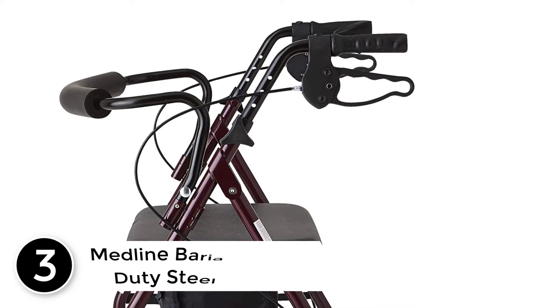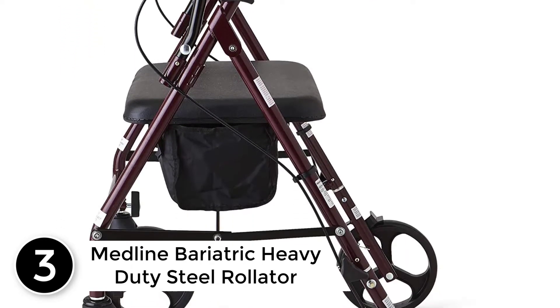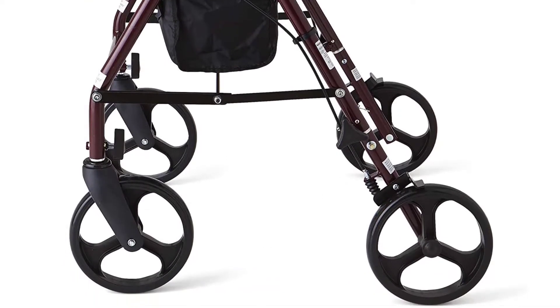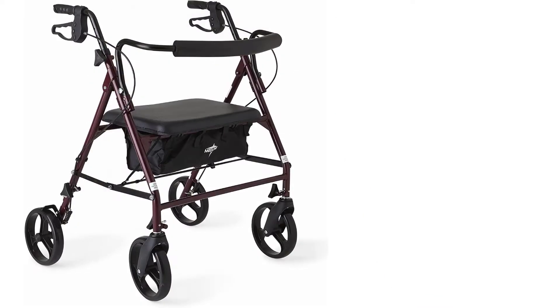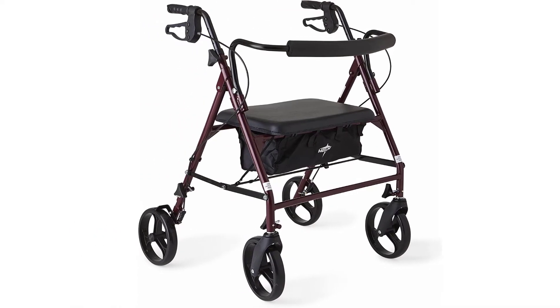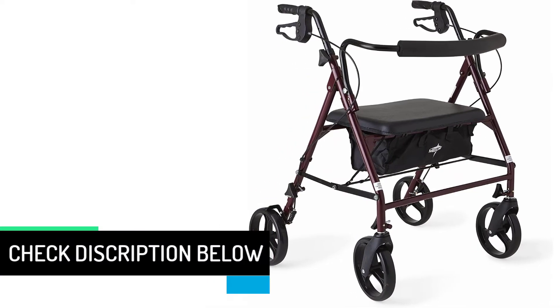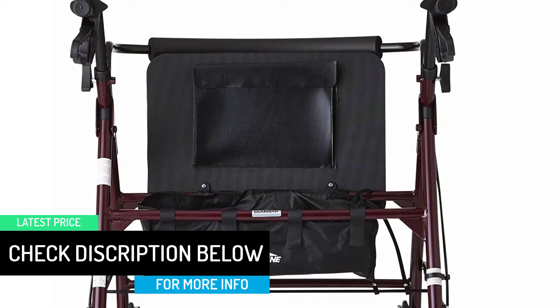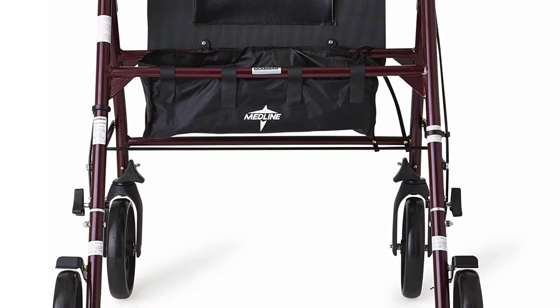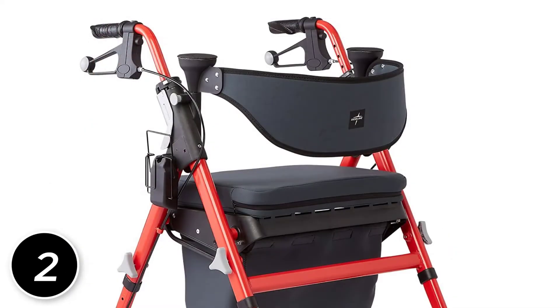At number 3: the Medline Bariatric Heavy Duty Steel Rollator. It features a durable steel frame and large 8-inch wheels. This heavy-duty rolling walker is ideal for persons with health and rehab conditions, featuring height-adjustable handles and greater distance between the handles for seniors and people who need extra room. Built for comfort, it has a padded seat and back support so you can sit and rest after walking. The foldable design makes it super easy to store away when not in use.